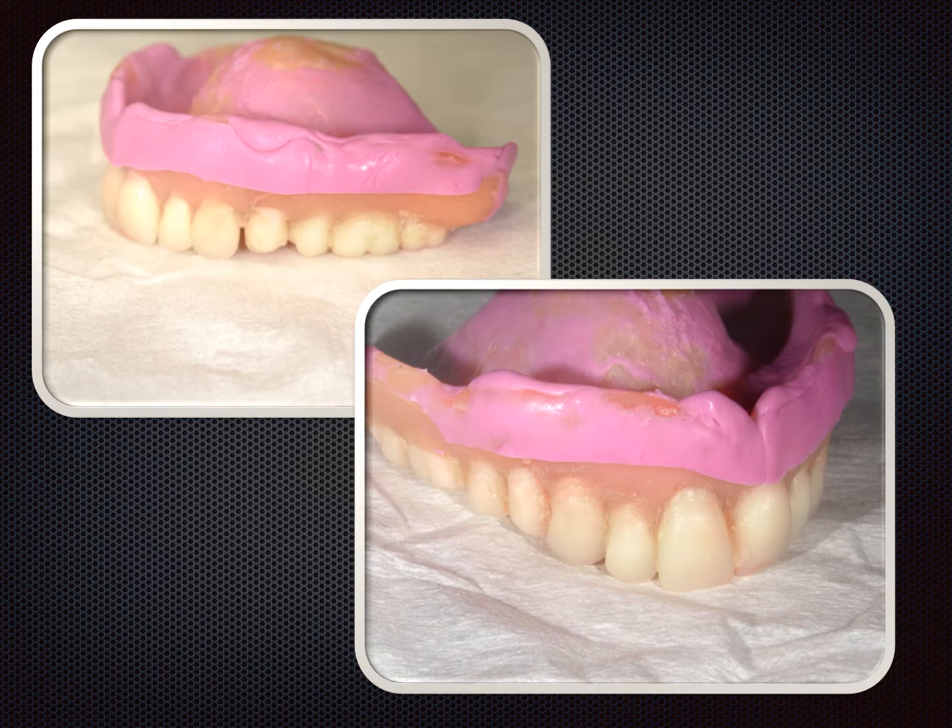Using a lab blade or scalpel, I'll trim the material back. It's very important to trim this back because we will be using this reline as a reference for the existing occlusal plane, the size and shape, and the midline. In a traditional sense, these are the markings you'd use with a stabilized baseplate occlusion rim. The more information we can pick up in this scan, the more useful it is to the technician when designing the final denture.